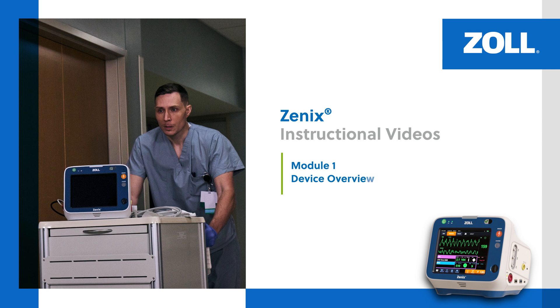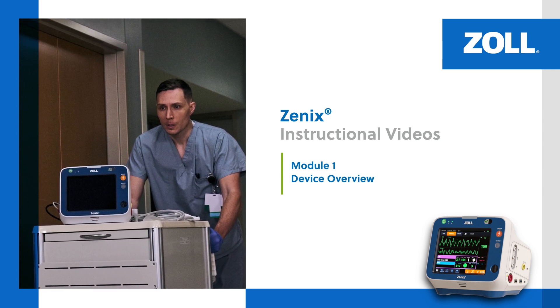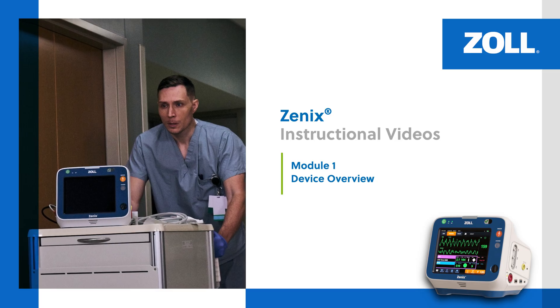In this video, we provide a basic overview of the Zenix monitor defibrillator, its connection ports, and the features on the display screen.